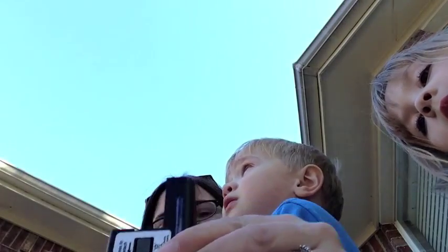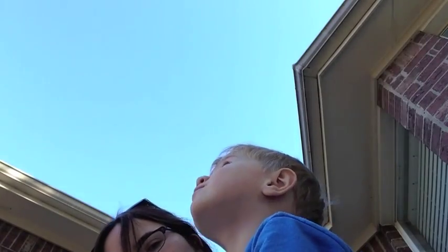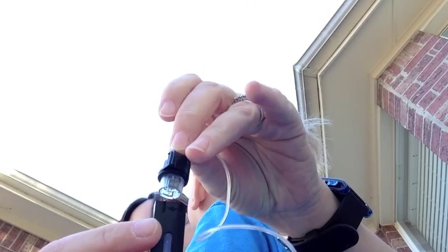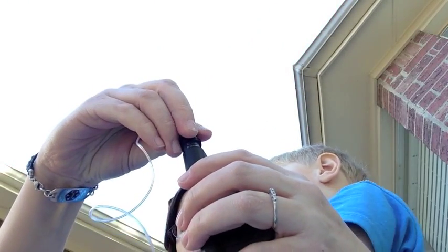You just snap it in and it will lock up. And then I have a new set which has the connector cap on it. And then, upon connecting, we will get instant priming. So I hold it upright, twist the connector cap on, and if you can see, it's already primed.